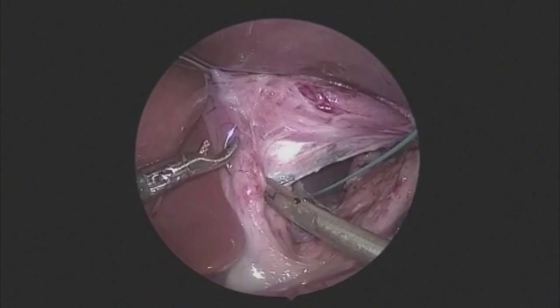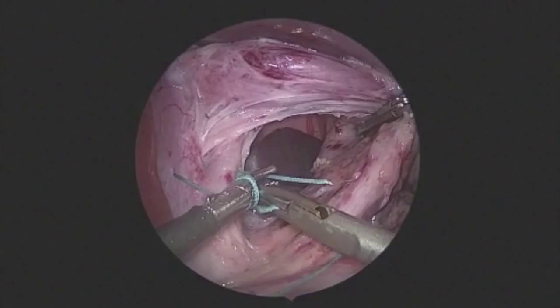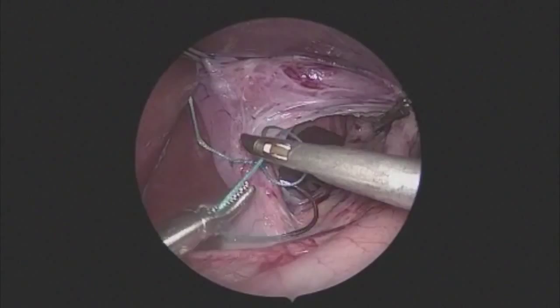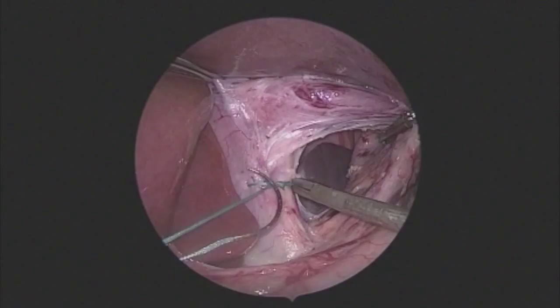By using the three millimeter sealer, we have avoided the use of a five millimeter port even in this larger child, and it is quite easy to put the needles in through the abdominal wall. In general, we will leave the needle intraperitoneal until we are done with the fundoplication, then remove all sutures and needles out through the trocar site rather than feeding them back through the anterior abdominal wall.